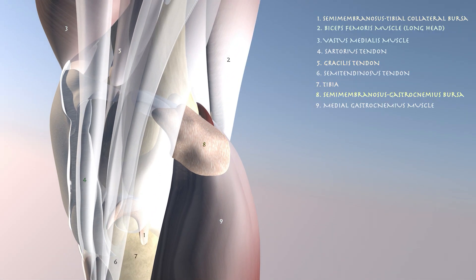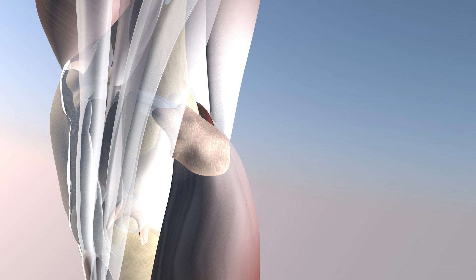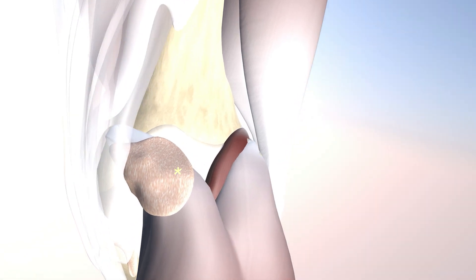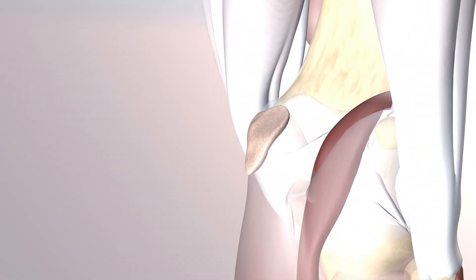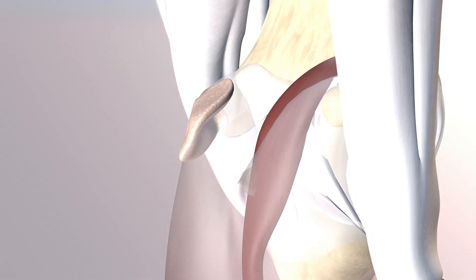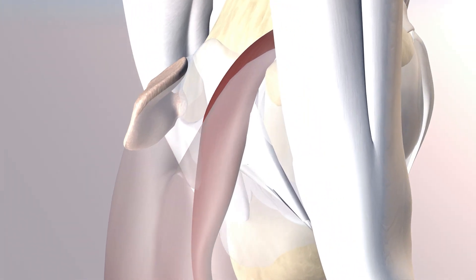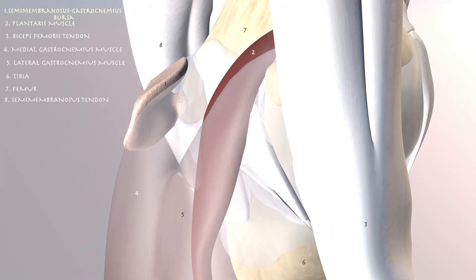Here we can see the semimembranosus tibial collateral ligament bursa that drapes over the distal semimembranosus tendon. Here we're looking at the semimembranosus medial gastrocnemius bursa — your typical popliteal cyst — basically draping over the medial gastrocnemius muscle and tendon, concave laterally.